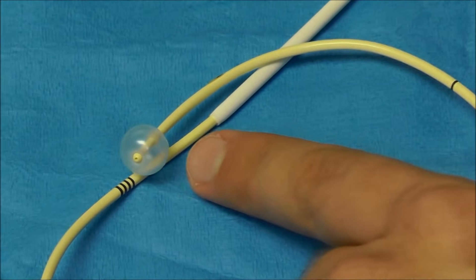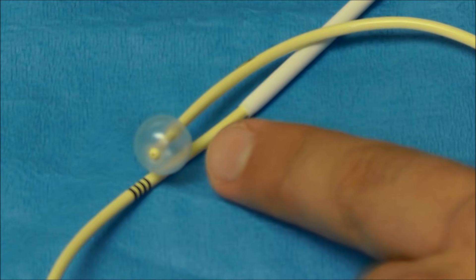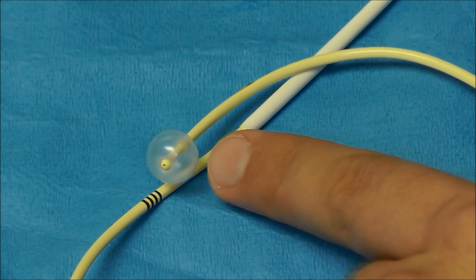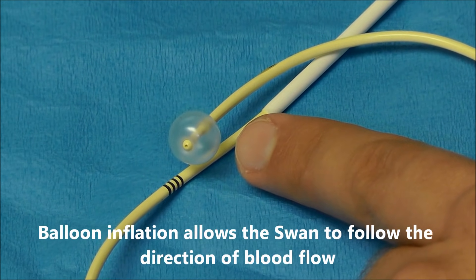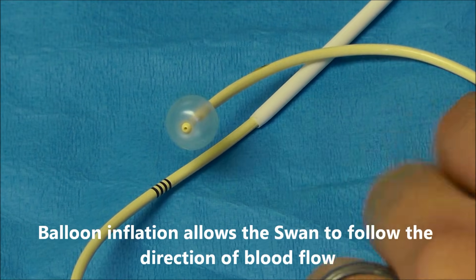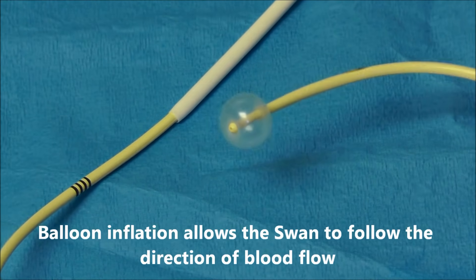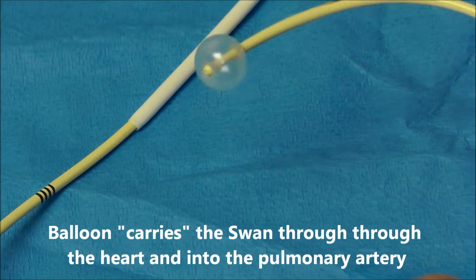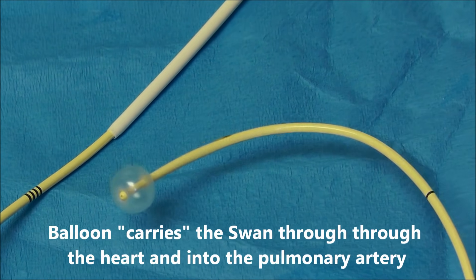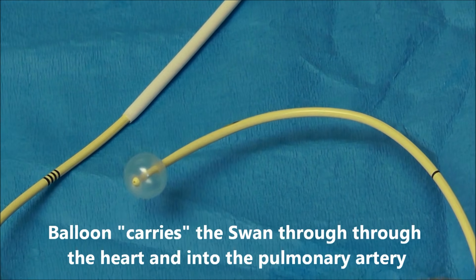This balloon acts kind of like a sail on a sailboat because when this balloon is inflated, it follows the direction of the blood flow. And so assuming that this catheter is not coiling up, the blood flow should guide this from the right atrium into the right ventricle and into the pulmonary artery.